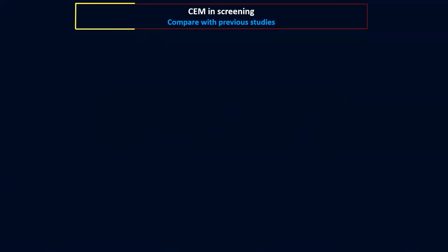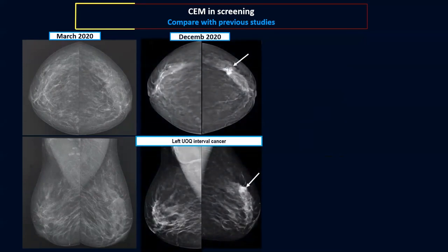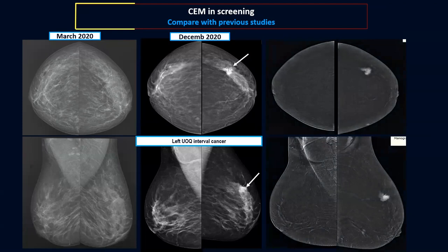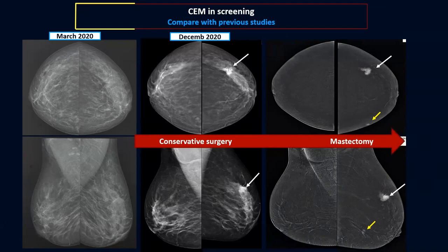In screening, we have to compare with previous studies. This female had a mammogram in March 2020, then came in December 2020 feeling something in the left upper outer quadrant. We repeated the mammogram and found a small cancer — a cancer which develops between screening intervals is called an interval cancer. Her contrast mammogram showed intense heterogeneous enhancement of the mass, and in addition, a tiny lesion not seen on the standard mammogram. The management changed from conservative surgery to mastectomy based on multicentricity of the lesion.